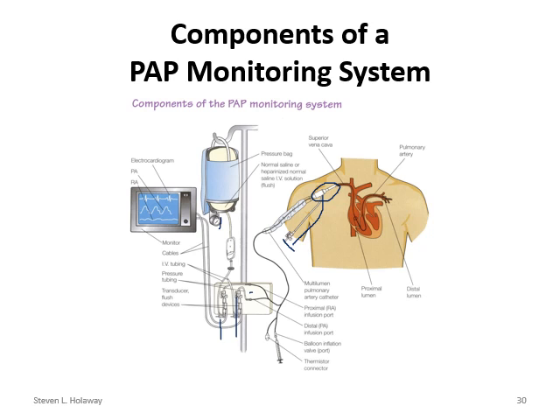This should be at 300, and it's delivering saline down to these to keep these open. So the whole part of the monitoring system includes a monitor, a pressure bag, a transducer, and a catheter. So as you look at it, all of this is part of this whole monitoring system. All of those are necessary to actually get a monitoring process on that patient.